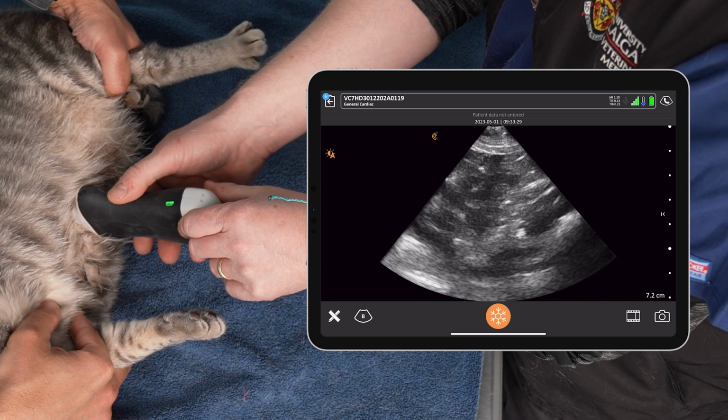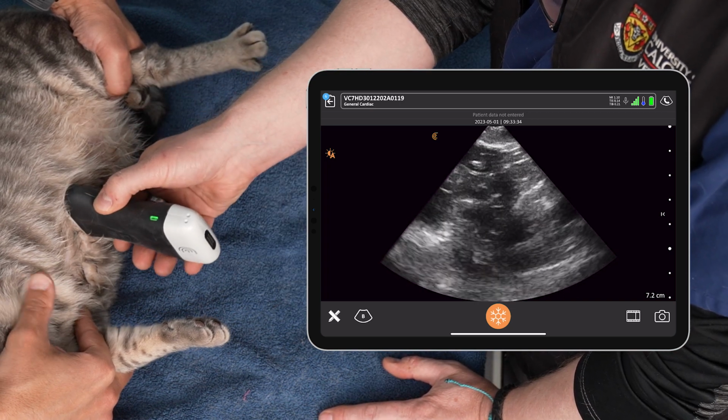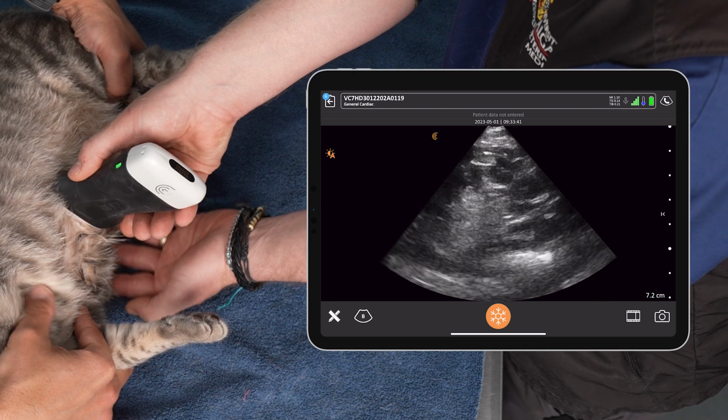And then we're going to rotate the probe into short axis at this site as well. Again, we'll fan cranial, we'll check the intestines, we'll fan caudal, we'll rock the probe down towards the gravity-dependent region, again with our patient lateral looking for fluid where my fingertips will be.